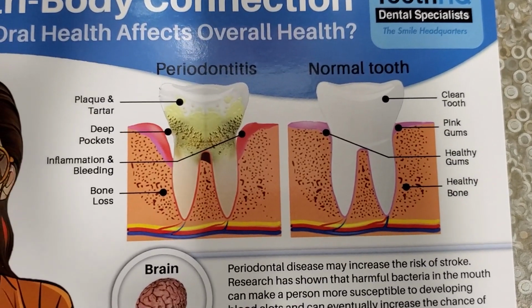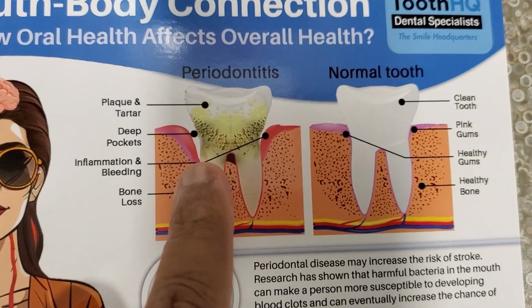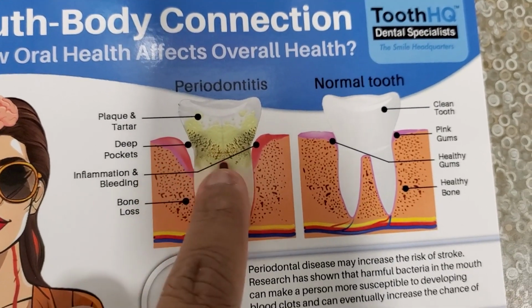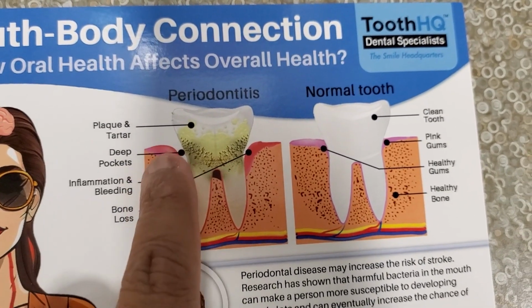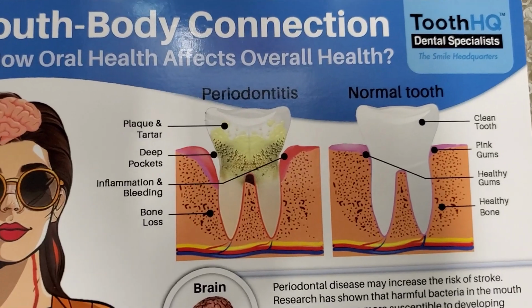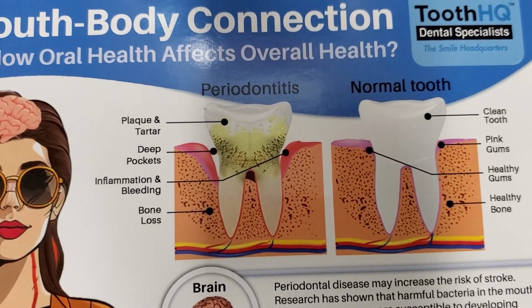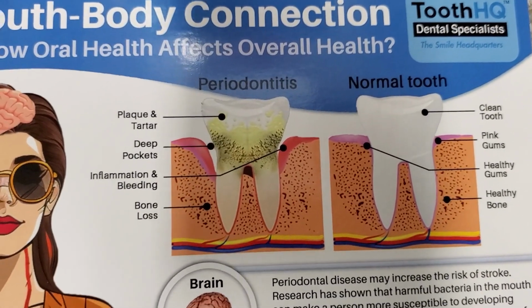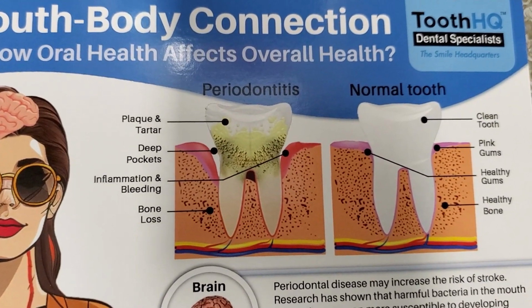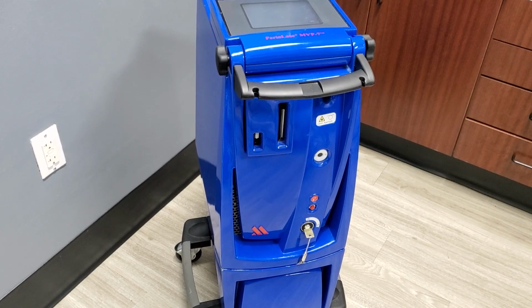So when patients are getting just a regular deep gum therapy, as surgeons, what we normally do is remove the tartar under the gum line after giving patients numbing, and try to remove all the tartar and the plaque and all of that, to clean the tooth around for the tartar and the plaque. But in laser, not only are we going to do the deep gum therapy using the tartar removal and the plaque removal, but we are also going to pass the laser using the laser machine.